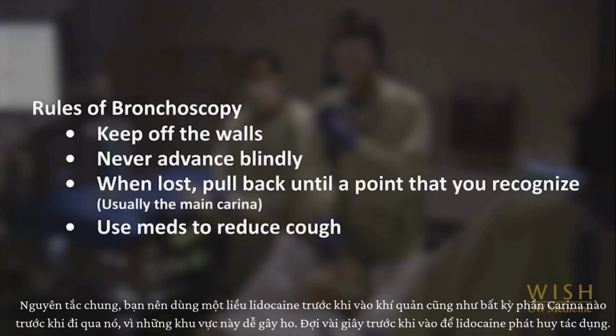As a general rule, you should give a dose of lidocaine prior to entering the trachea and at any carina before advancing past it, as these areas are prone to causing cough. Then wait a few seconds before advancing for the lidocaine to take effect.